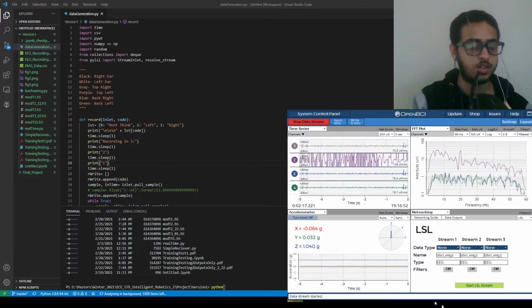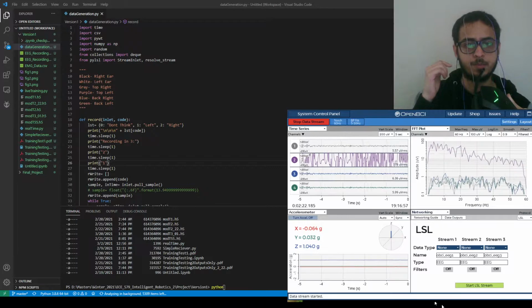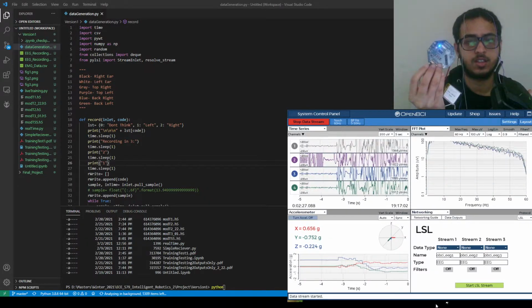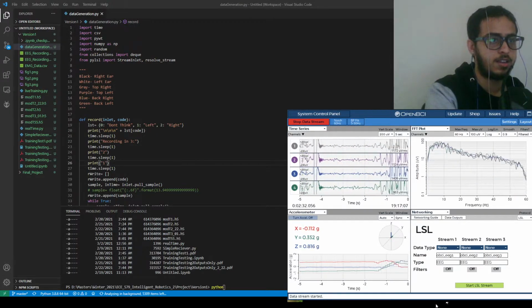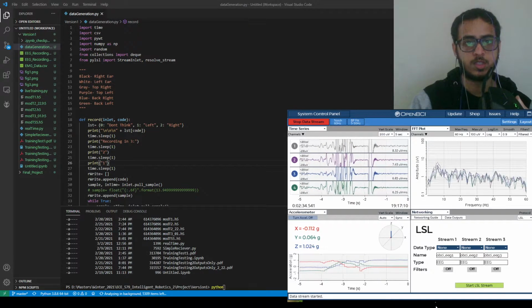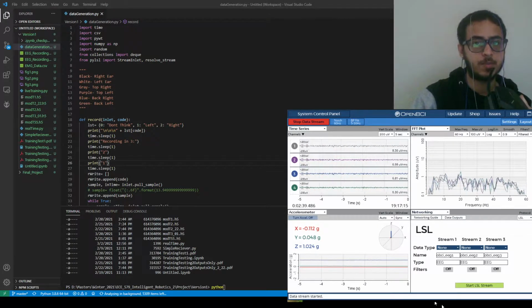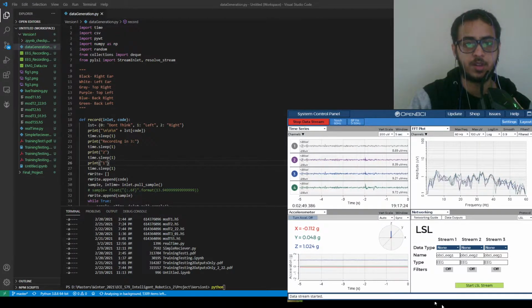Open BCI as well. So what happens is the values from these electrodes are read, gathered by this Ganglion board here, which filters and amplifies the signals and sends them to this Open BCI software over a Bluetooth dongle, and this software displays the values received and its FFT plot. In this project, I do not use this FFT plot here. I just use these time series signals.